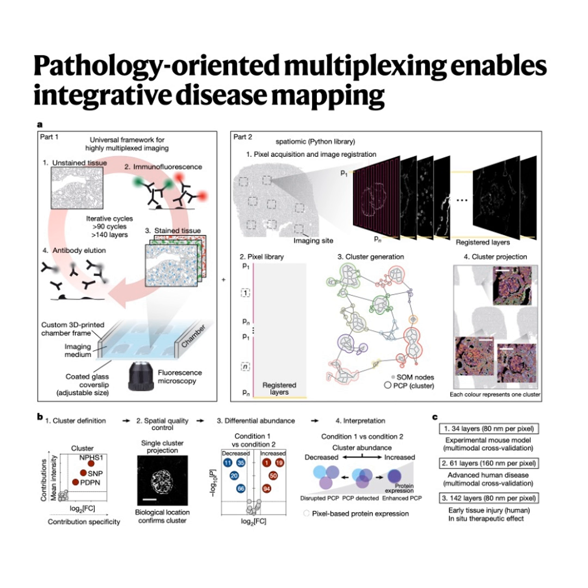It absolutely is. And this is where they made a really important practical discovery. Most labs use something called poly-D-lysine to coat slides and make tissue stick. Right, standard stuff. But PathoPlex testing showed that even with poly-D-lysine, about 15% of their kidney samples started lifting off the slide after just 49 cycles. That's obviously not workable for large experiments. Yeah, you lose data, waste time. Exactly. So their solution was switching to a different coating, APT, which is 3-aminopropyl triethoxysilane.